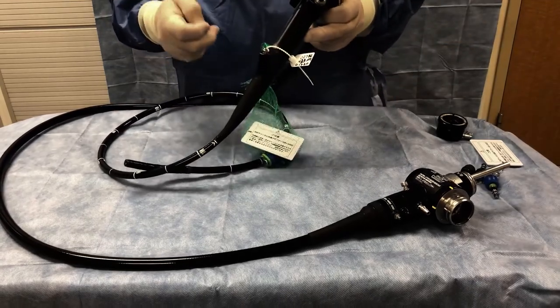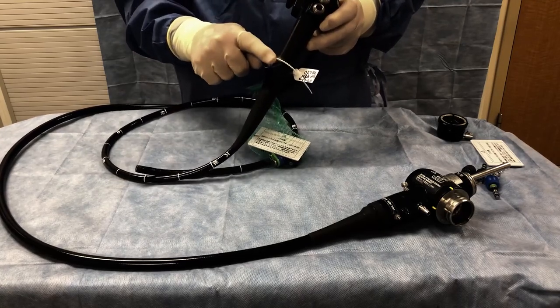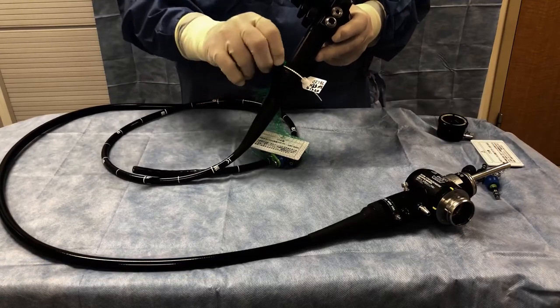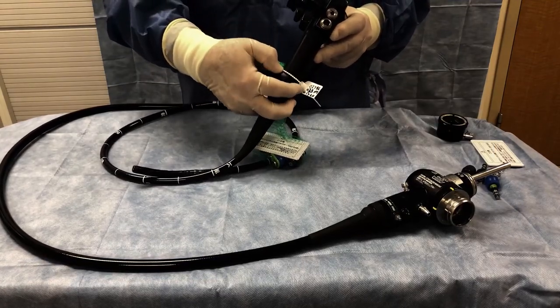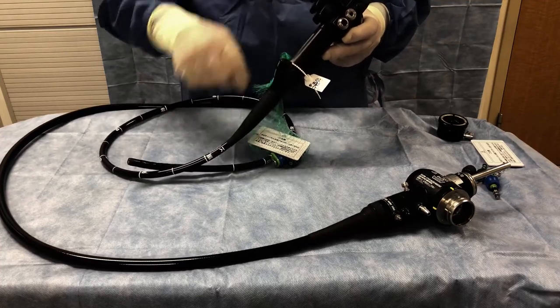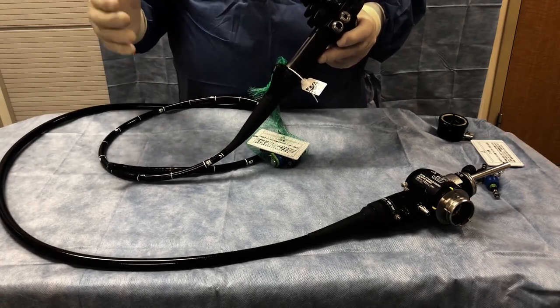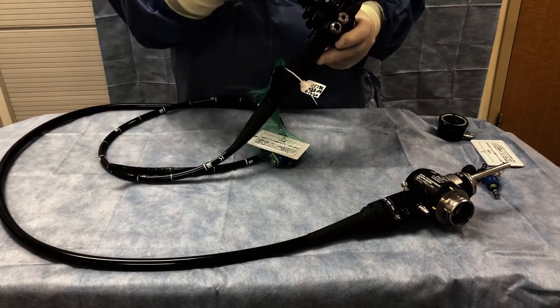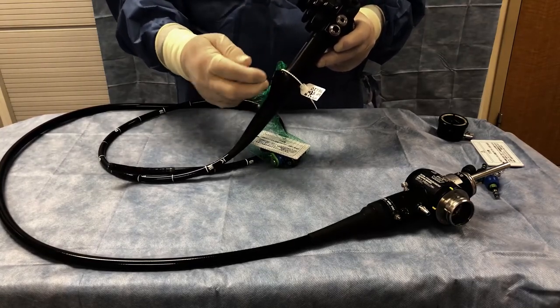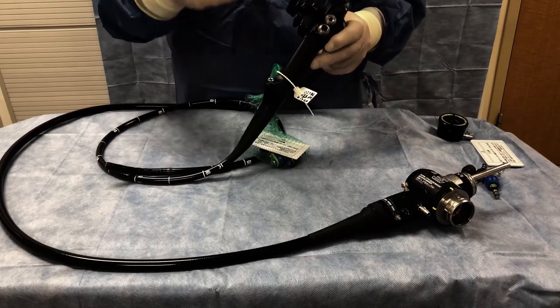This is the working channel of the scope — 2.8 millimeters, also known as a biopsy port. This little cap or valve goes onto that port, and the nice part is we can push instruments through the top part even when it is closed. That way, the gases we are insufflating the organ with will not escape, so we can keep things insufflated even when pushing instruments in and out of the scope. For some larger instruments we open this up, but that is what it is for.